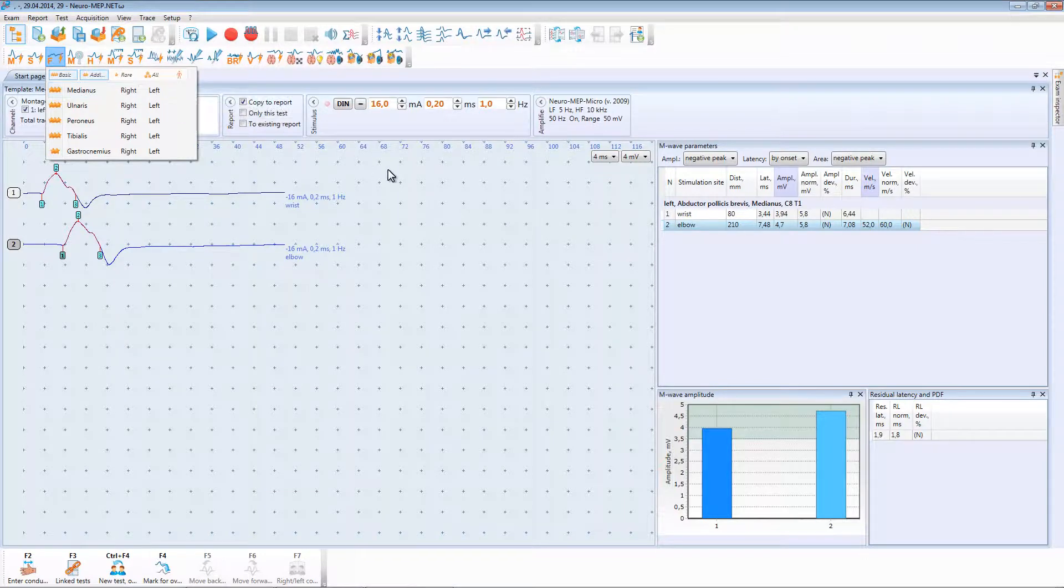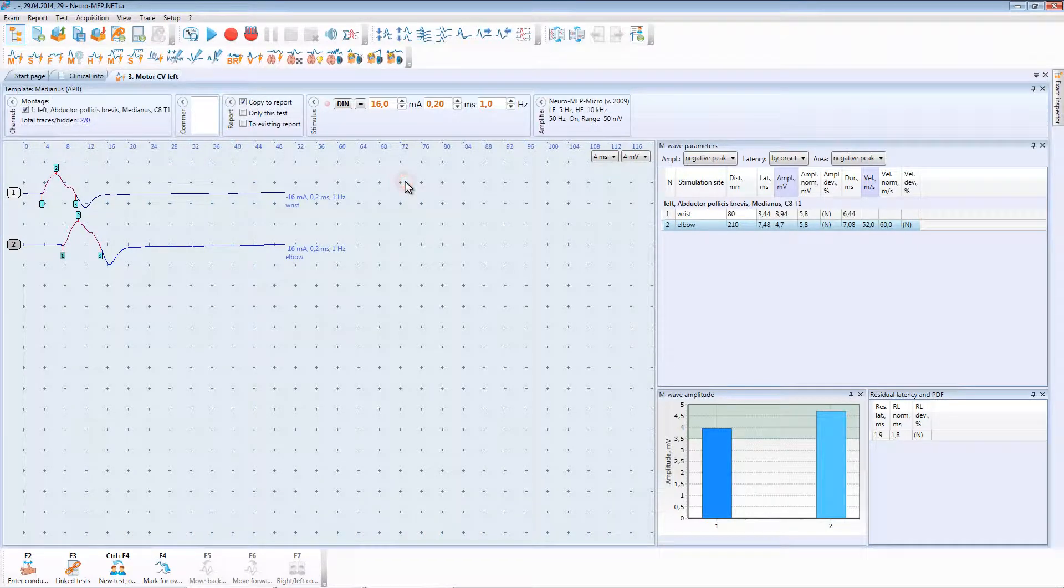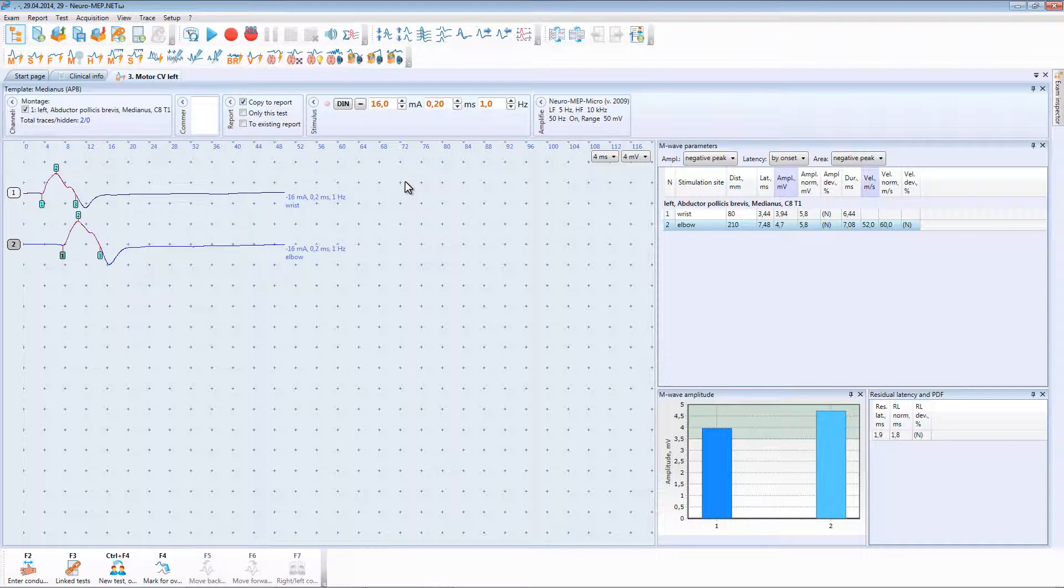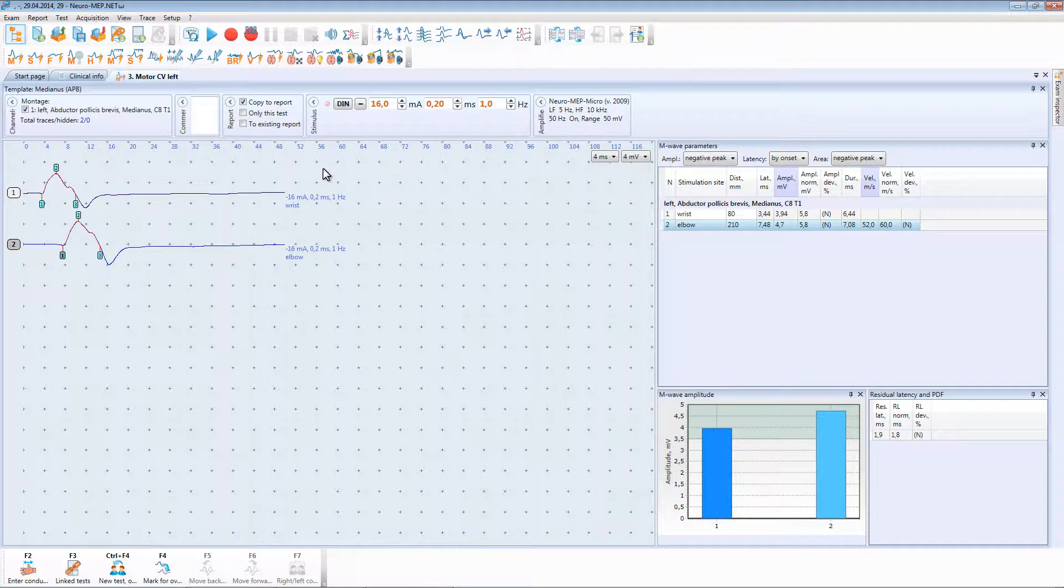Or you can also create linked test from the motor conduction velocity window. In this case the required test will be created automatically because we have already chosen the studied nerve and site in the motor conduction velocity test.